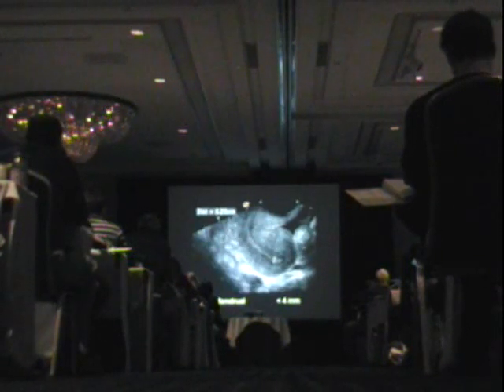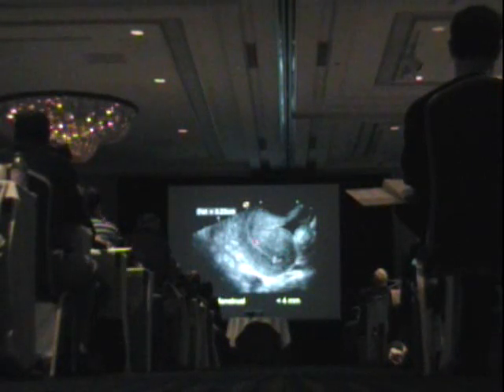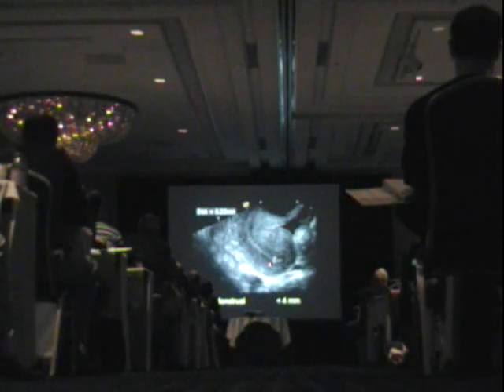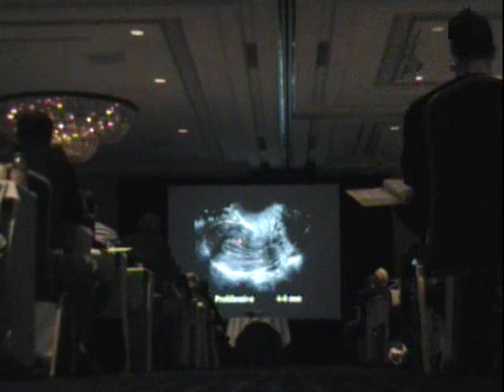So here is a measurement done in a retroverted uterus. The cervix is here, the fundus points posteriorly, transvaginally, and we see a thin linear stripe with a measurement of about 2 millimeters. This is the menstrual phase of the cycle, where the stripe is thin, linear, and under 4 millimeters. As the menstrual cycle progresses, we get into the proliferative phase, where we see a multi-layered look.